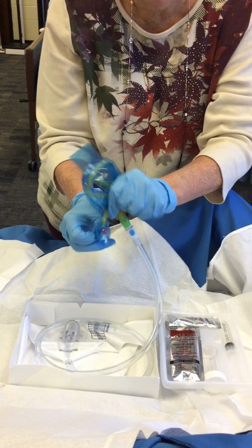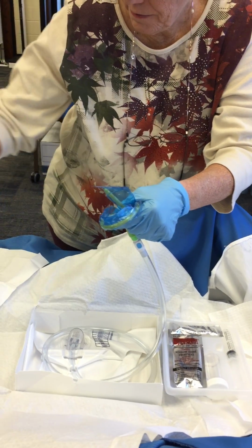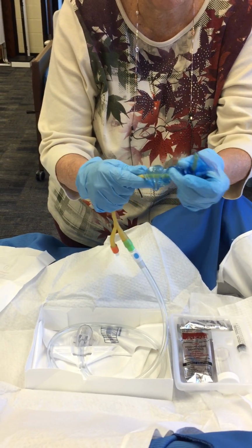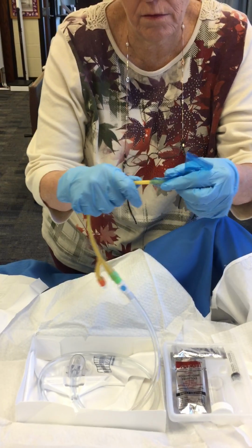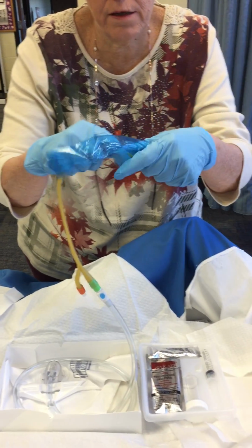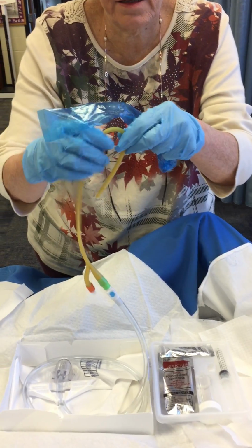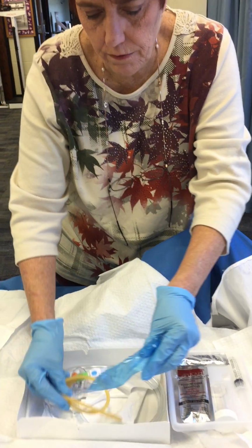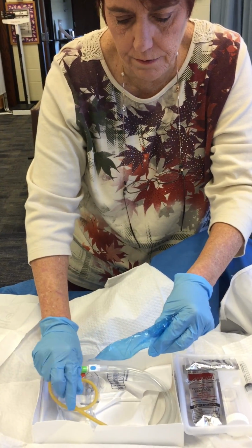It should be perforated here somewhere. There it is. Be very cognizant of where your catheter is. It's really easy for them, this thin rubber, to flop around on you if you're not careful.